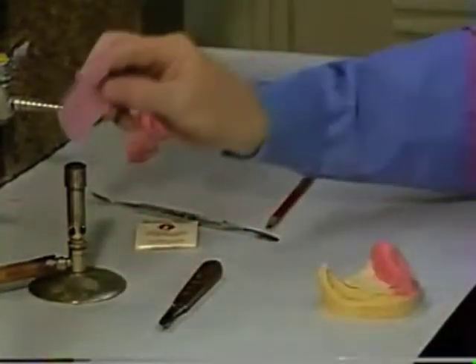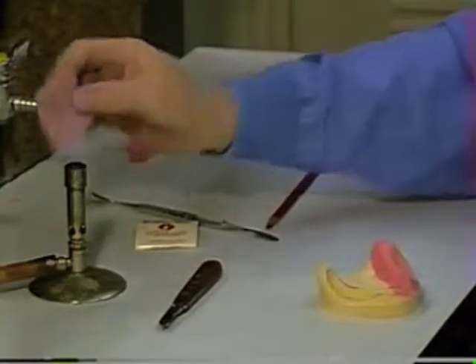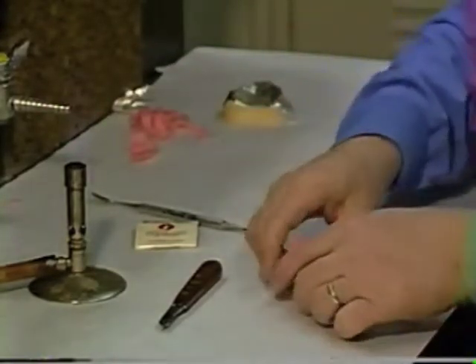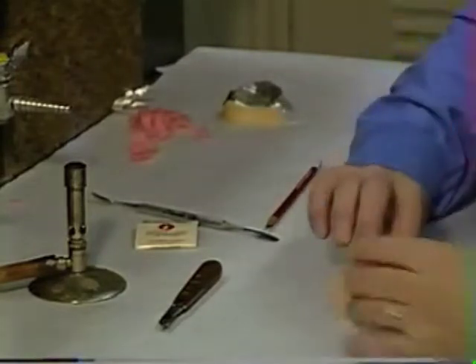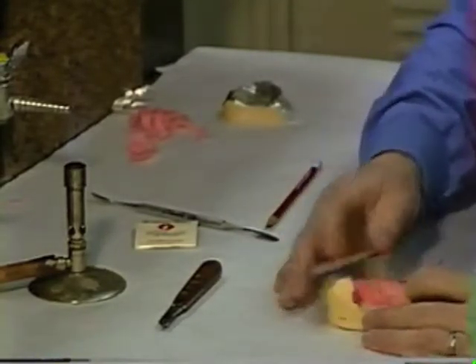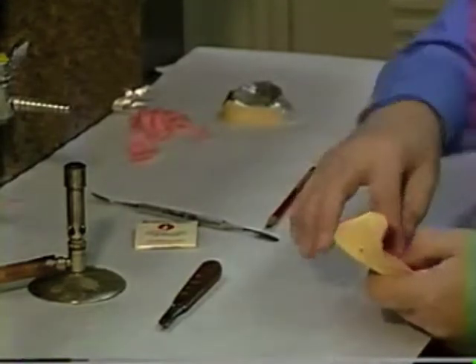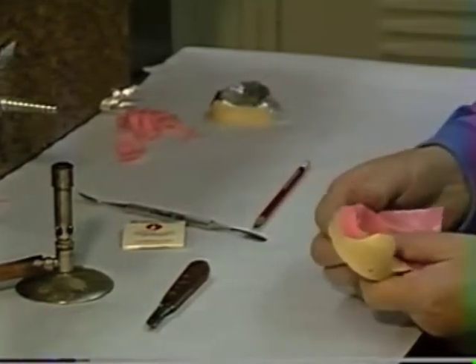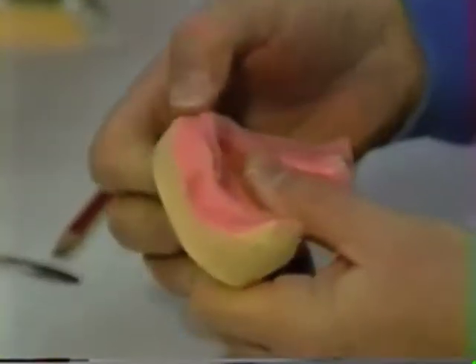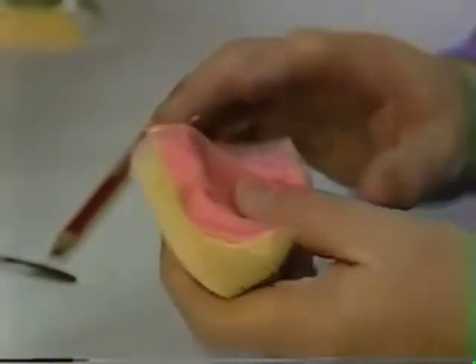Cut a piece of wax and adapt it to the cast, soften it real well, adapt it to the cast just like we did on the opposite side. Again, we'll start this on the lingual and adapt it well into the mucolingual fold and adapt it well to the cast like so.